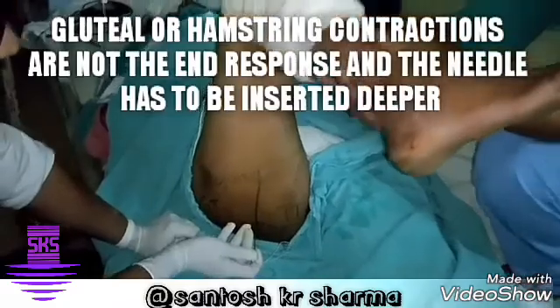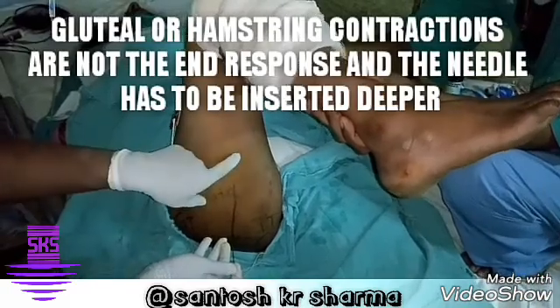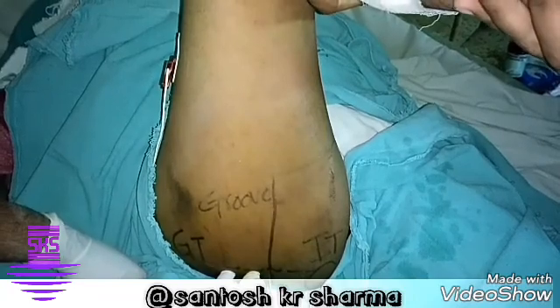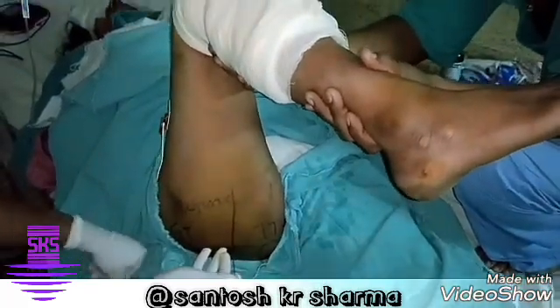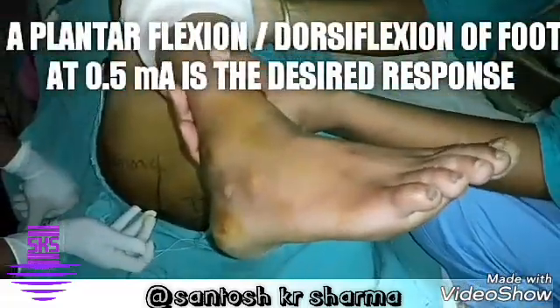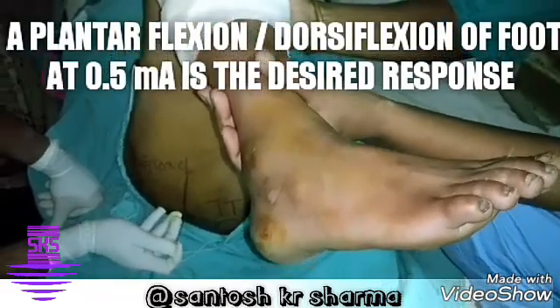This is the gluteal response — no, this is a hamstring response. You can appreciate the hamstrings are contracting. This is not an ideal response because many times the fibers that supply the hamstrings have already differentiated; we should target a plantar response instead. Let me go a little deeper — and we are getting a plantar flexion response. We are in the right proper plane.